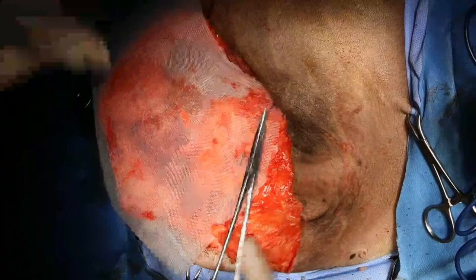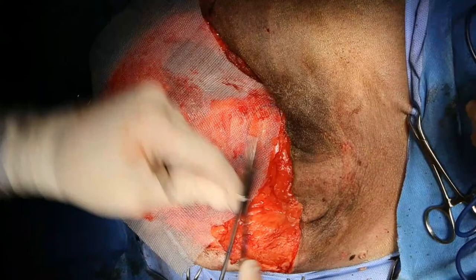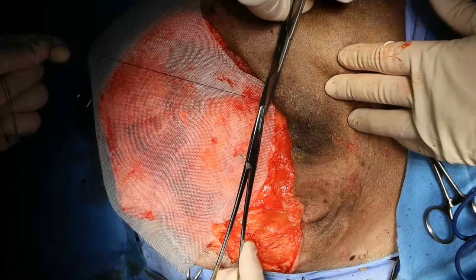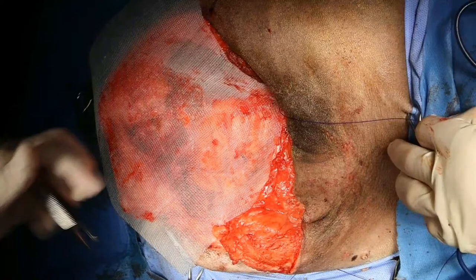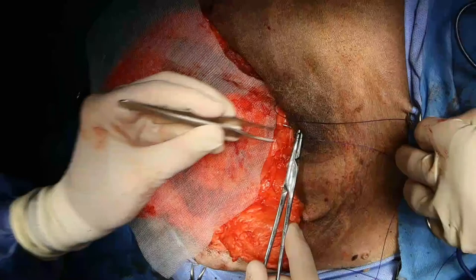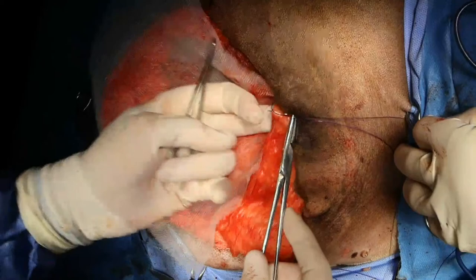And so now we process it ourselves, and we pay $4 a sheet. So the cost savings. I have about 2,000 sheets of polypropylene mesh from this one roll. That I bought once about 15 years ago. Has the technology changed at all since then? No. I mean, there are different types, but polypropylene mesh is still polypropylene mesh.